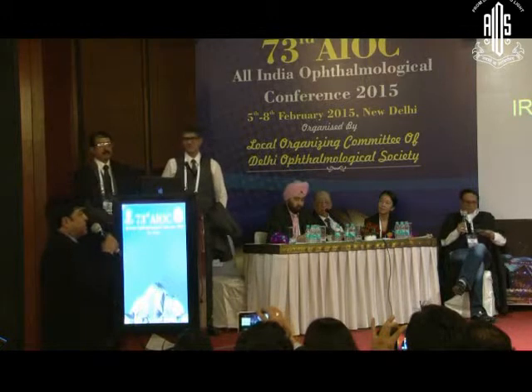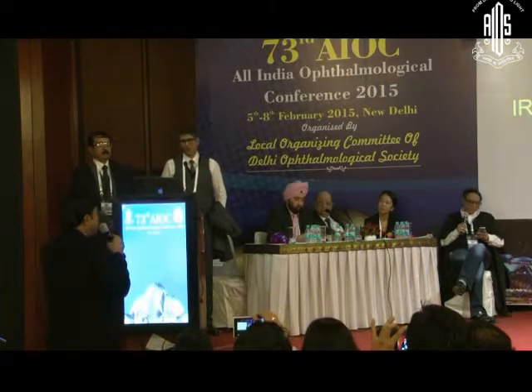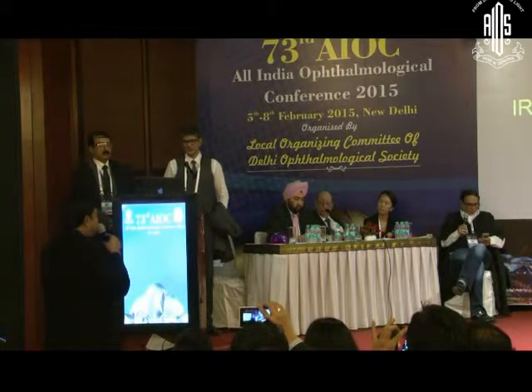And then a year and a half later, he developed this anterior subcapsular cataract. And then we were wondering what to do. And then this is something we did innovatively, and the patient was also very happy that he could still maintain his ICL because he had paid so much. I think with ICLs now being accepted as an answer to high myopia and high hypermetropia, he has come up with a very innovative way, keeping the ICL there.